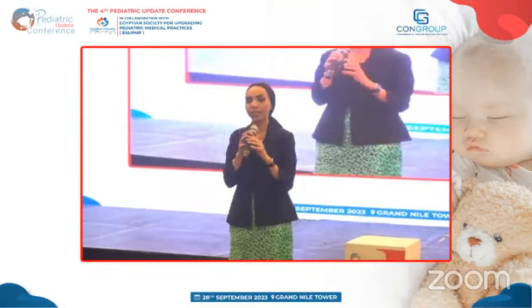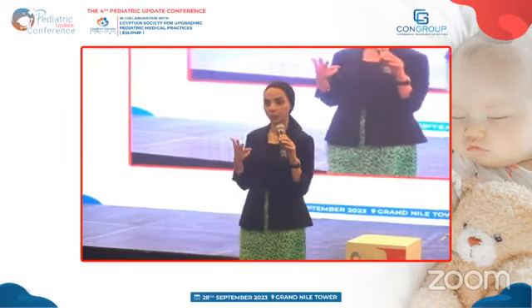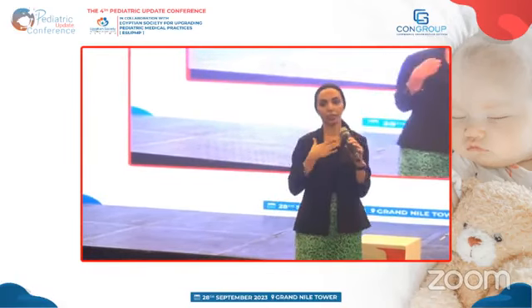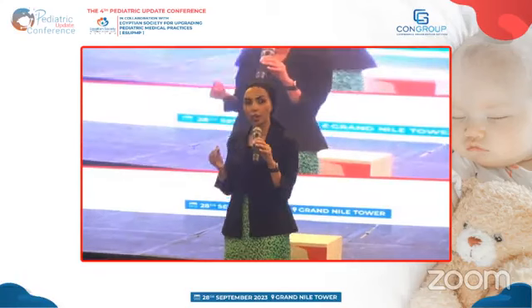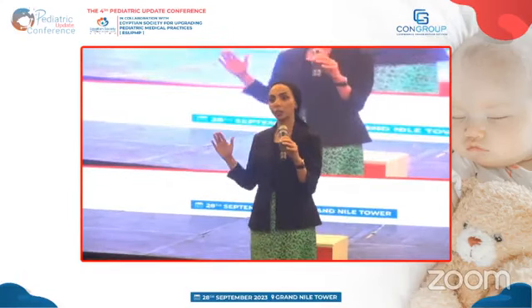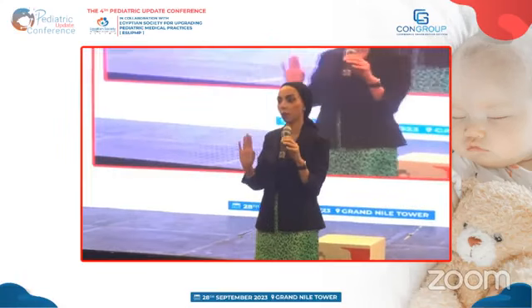حاجة تانية مهمة هي التارجتس بتاعت البيزل. انا هنا عندي 3 تارجتس: 100 او 110 او 120. ممكن ابدا مع البيشنت بتاعي على ال 120 لو انا عايزة الاول، انا كونزرفاتيف وخايفة من الهايبوجلايسيميا، فبقول للسيستم والالجوريثم بي لس اجريسيف، ادي لس انسولين، فممكن ابدا بال 120. بعد كده بعمل مونيتورنج مع البيشنت بتاعي، كل ما هو كومبلاينت اكتر ابدا انزل معاه بالبيزل. الاوبتيمم سيتنج ان انا اوصل معاه لل 100، يبقى هو ده التارجت بتاعي على مدار اليوم.